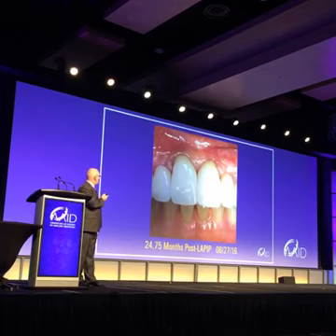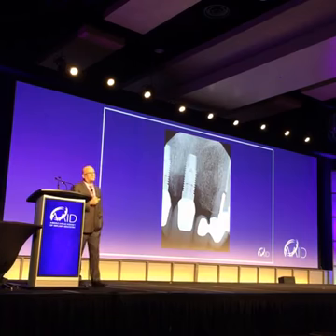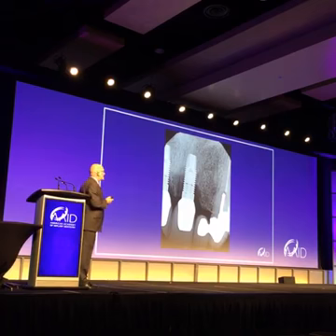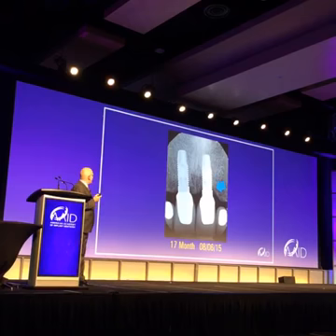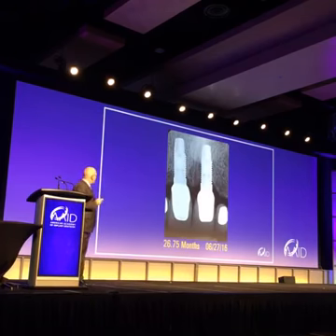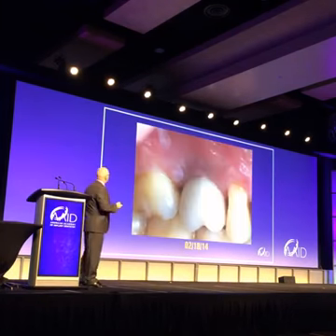Almost a little over 2 years later, she needs to work on her hygiene. I'd like that tissue to come down a bit more, but it still looks good. She's happy. But more importantly, look at the bone loss. How would you treat that with a flap without totally ruining the aesthetics? Here it is 5.5 months later. The bone filled in. And 17 months later, that bone is still there. And 26 months later, this is just recent actually, that bone's still there. It's staying there. It's the person's own bone. This is not exogenous bone I'm putting in, waiting for it to turn over.